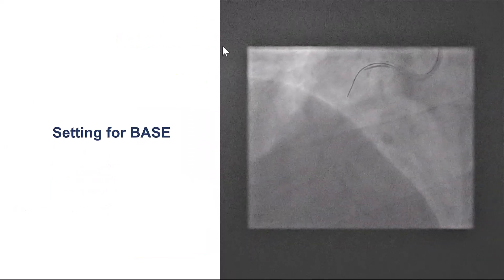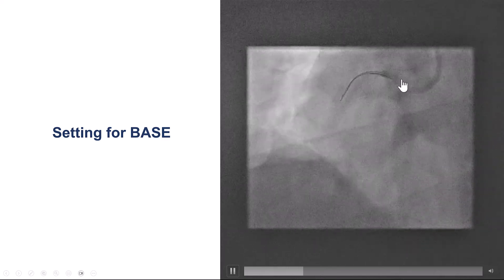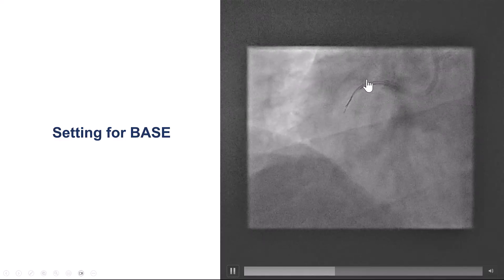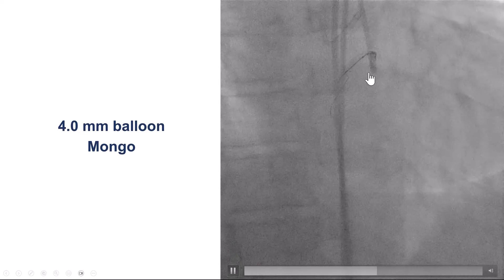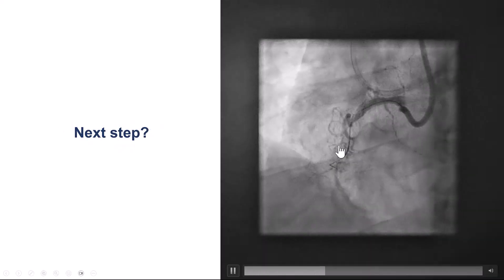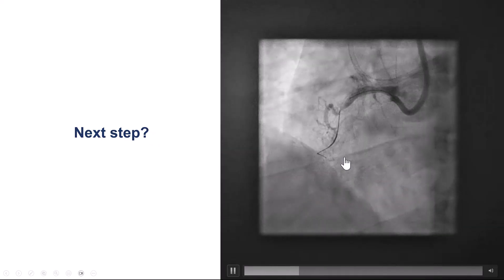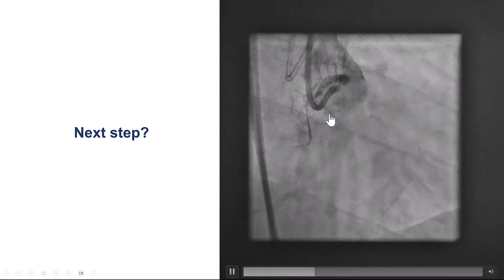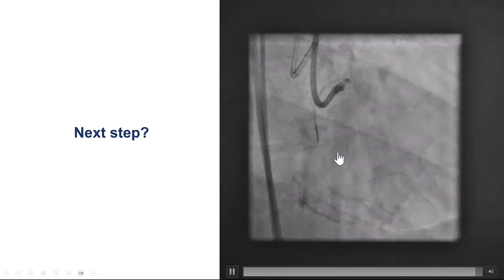We brought in a 4.0 mm balloon, slightly oversized, in the proximal vessel, with a Turnpike LP microcatheter right next to it. We inflated the balloon and pushed the Gladius Mongo wire, which seemed to advance extra-plaque and is now sitting at the distal cap. There is a trifurcation of two acute marginals and the distal right coronary artery. The wire is seen knuckled at the trifurcation.